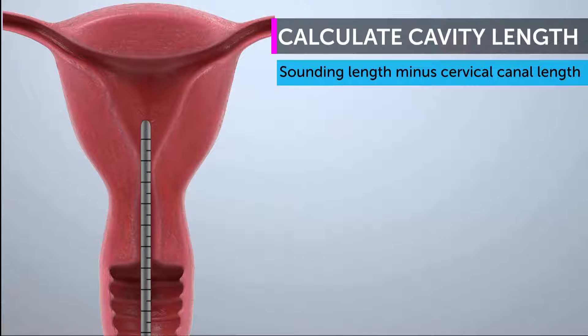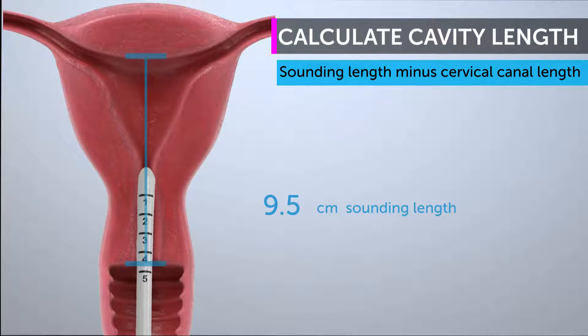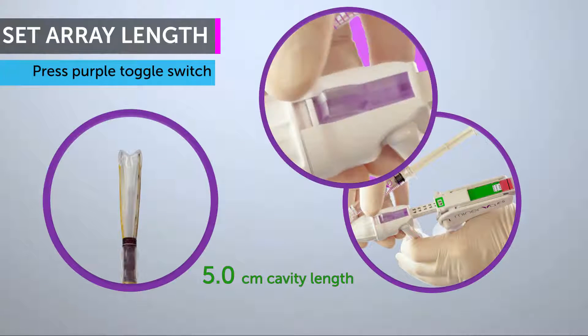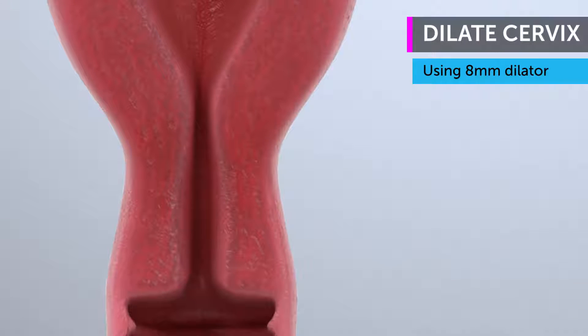Begin the treatment by first sounding the length of the uterus and subtracting the cervical canal length. Set array length by pressing the purple toggle switch and sliding the back handle to the correct cavity length. Dilate the cervical canal to 8 mm.